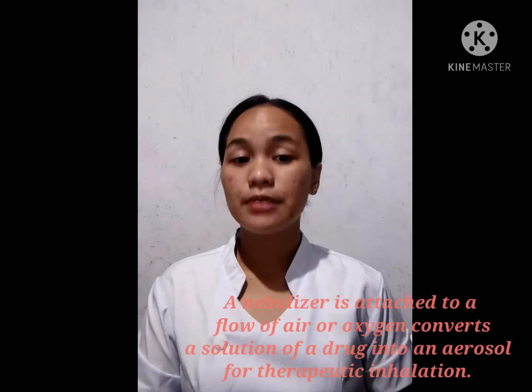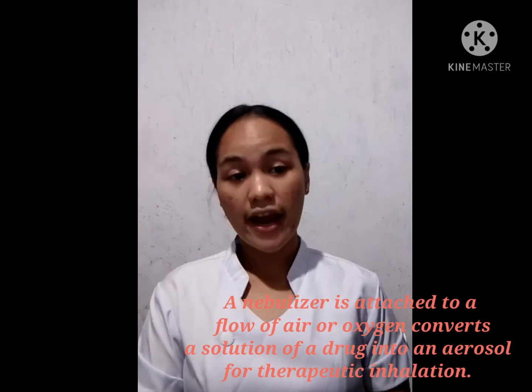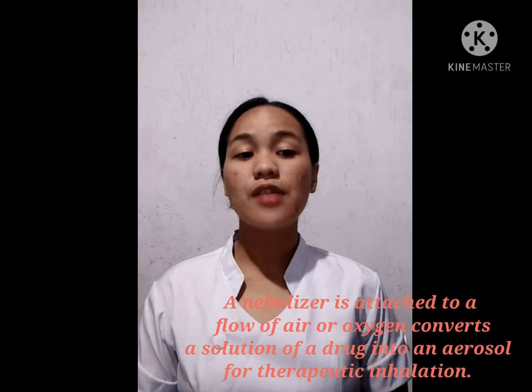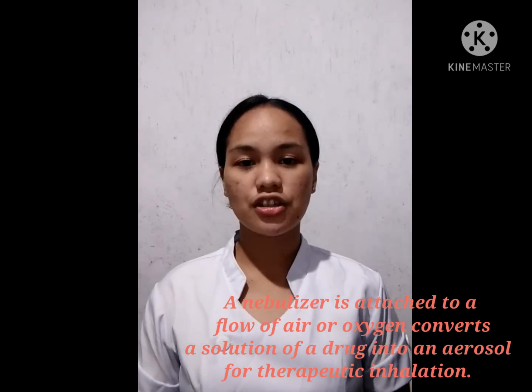Administration of medication by inhalation through nebulization therapy. As defined, it is when a nebulizer is attached to a flow of air or oxygen and converts a solution of a drug into an aerosol for therapeutic inhalation.